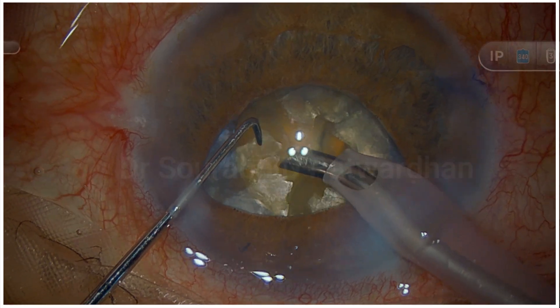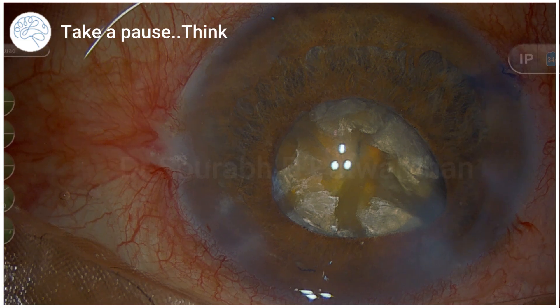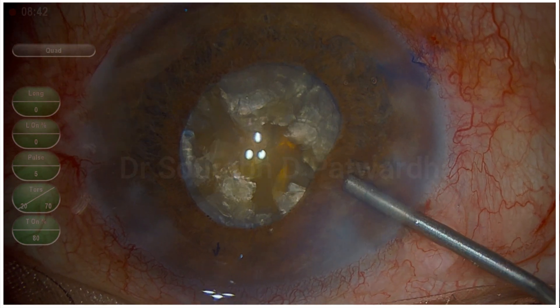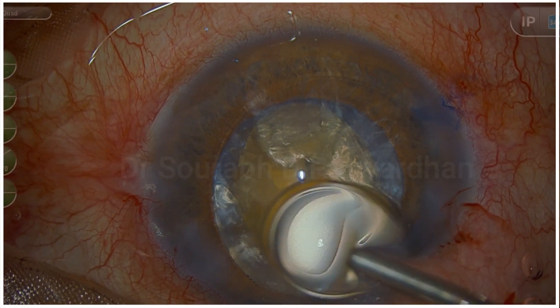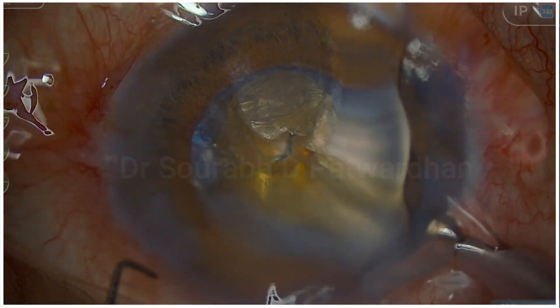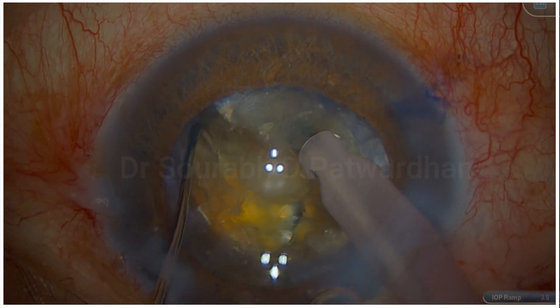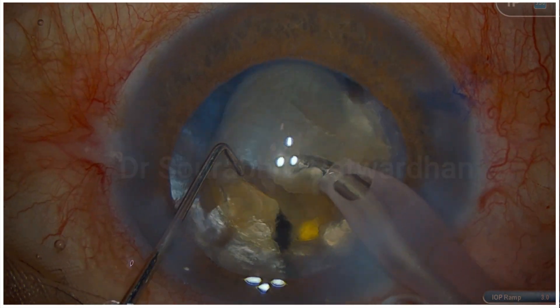The pupil has gone down, so it's time to take a pause and think ahead. There are two hemi-nuclei nicely separated. Ideally I would like one more division to make three pieces for emulsification — ideally five or six pieces, but the initial lack of depth during trenching and the incomplete chop has made further division difficult. I could still divide using the horizontal chop method, but the surgeon is not very used to that. The endonucleus has already been taken out, so deep-level chopping can be done using a blunt 1.5 mm chopper.